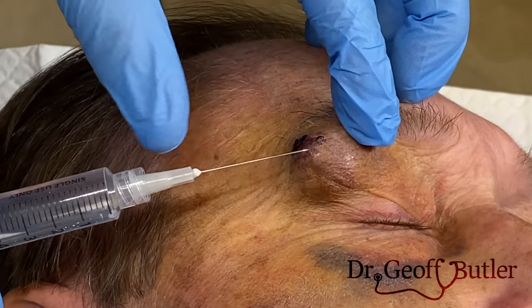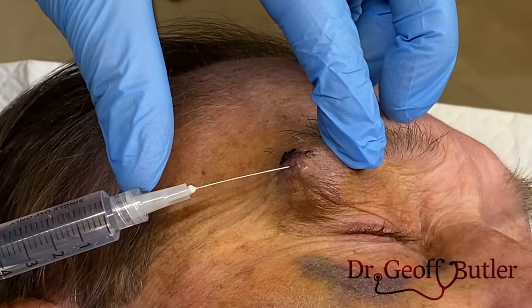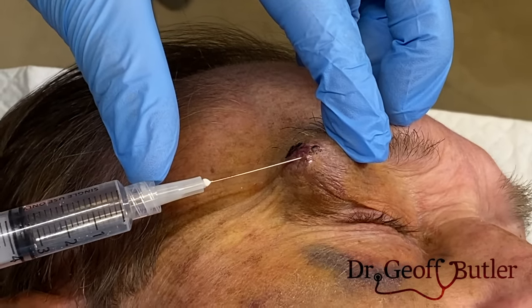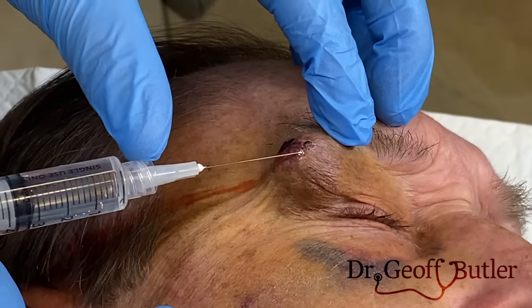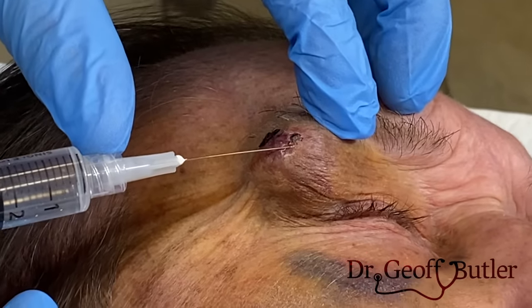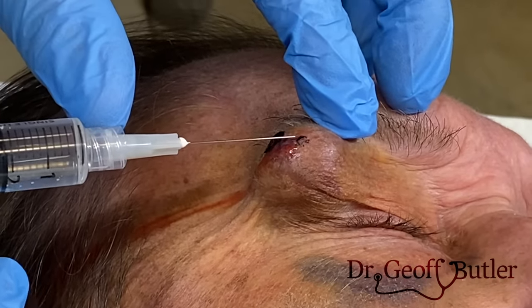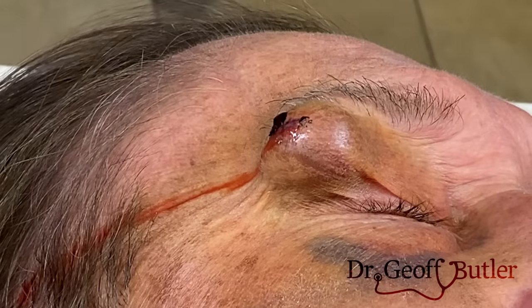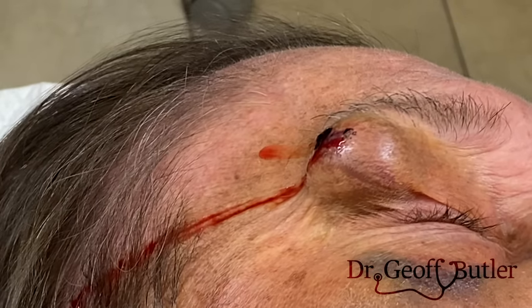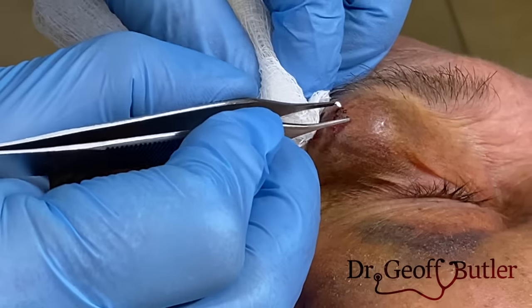Just like when you do a cyst, we want the injection to be very superficial. You're going to feel a poke here — I apologize. You're going to feel some burning. I really want just the bevel to go in. The more I feel into that space, the more uncomfortable it is for the patient. I'll check that freezing one second. Does that hurt when I do that? No.